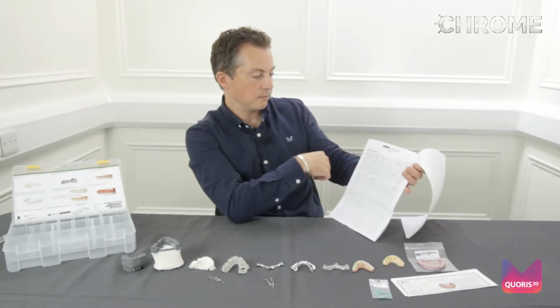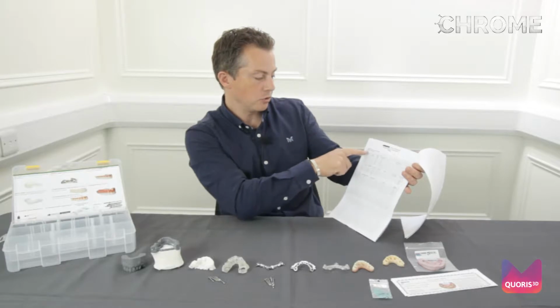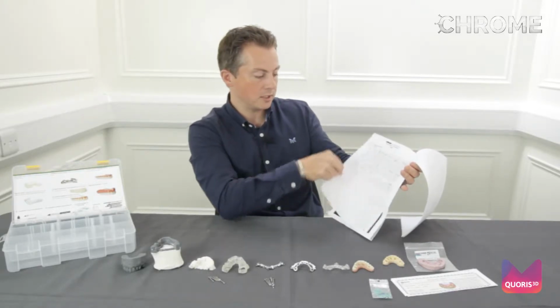As we go through the document, the next page then outlines for you the patient name, the drill kit, and the fact that it's been planned in Blue Sky Bio. It shows you all the implants, the pins, the diameter, the implant number, and also the angled abutments. So all the information you need is there.